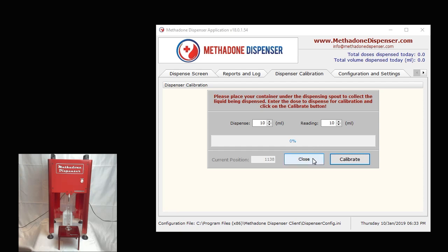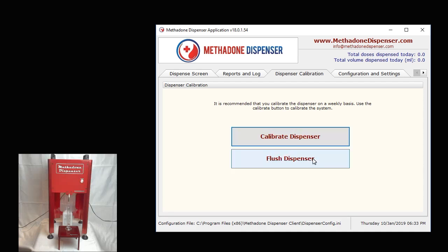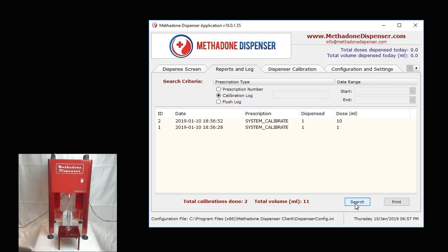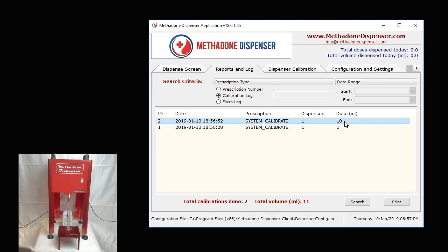Once the calibration routine is done, we're going to click on close. The beauty about this is that whenever you run a calibration routine, you can actually go to the reports and log. What you can do over here is you can search to confirm your calibration log. I can see that I did calibrate today for 10 ml as well as 1 ml. The capability of reporting and logs will be demonstrated in a follow-up video.